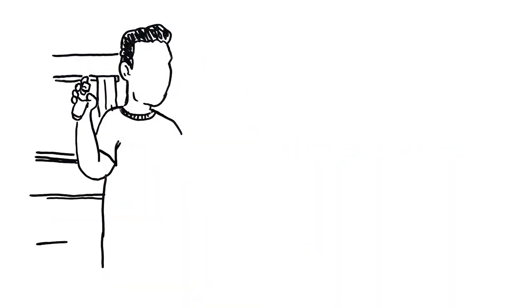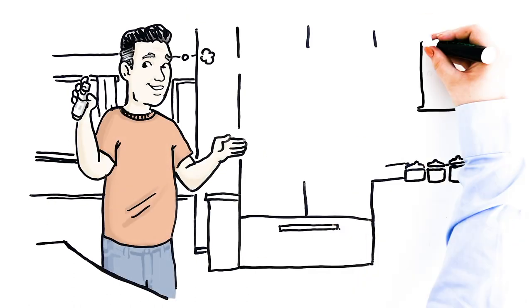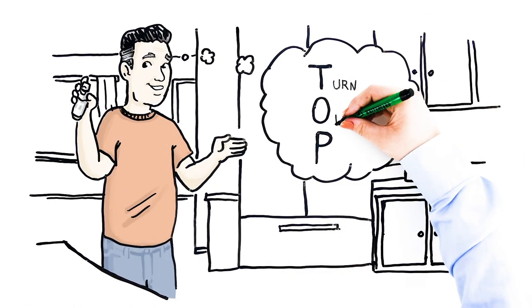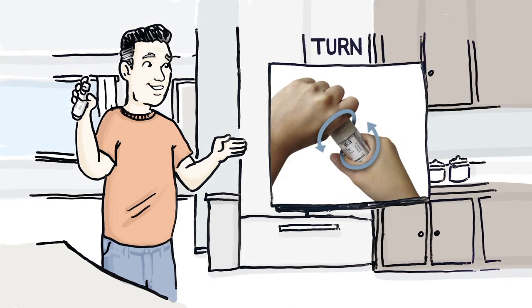To use his Respimat inhaler daily, Henry uses the word TOP to remember the steps. That stands for turn, open, and press. For turn, with the cap closed, Henry turns the clear base in the direction of the arrows half a turn until he hears a click.